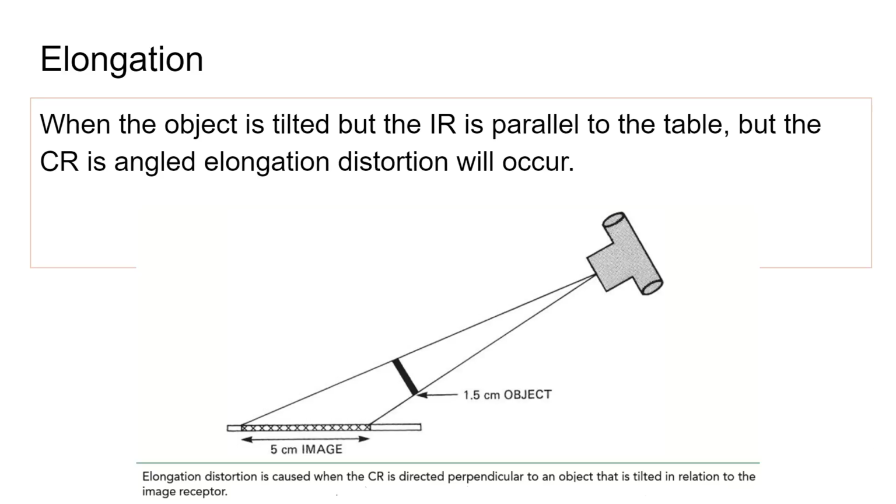It was a remote room. So we'll talk about this when we get to fluoro, but it was basically a remote control room from outside. So it was very easy for her to lay the patient on the table, control the fluoro with the joystick, and see where she was without the whole apparatus thing that we have in room 1. It was very easy to fluoro. But still, that's a huge exposure, unnecessary.